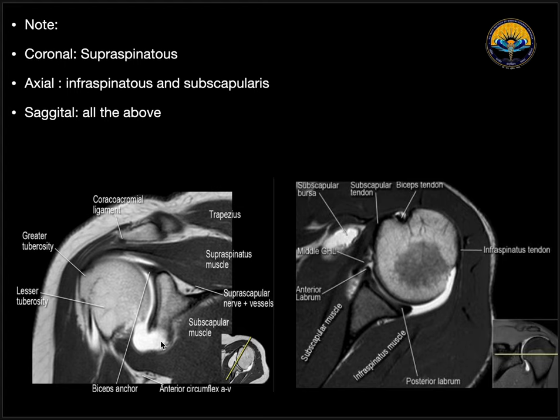So ultimately on coronal sections, we can see supraspinatus and its insertion very beautifully. On axial sections, we can see infraspinatus and subscapularis. On sagittal sections, we can see all of these muscles very beautifully. But the main importance of the sagittal section is to look for muscle bulk and to look for muscle atrophy or fatty infiltration.